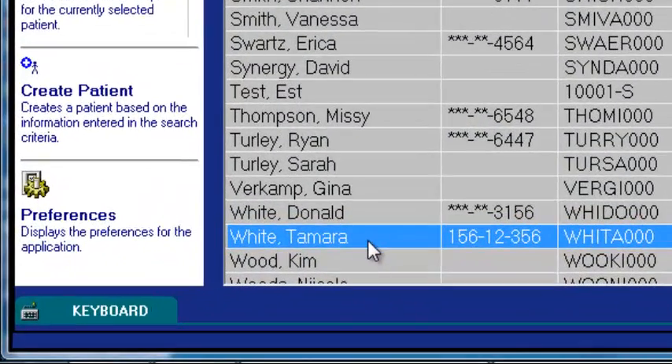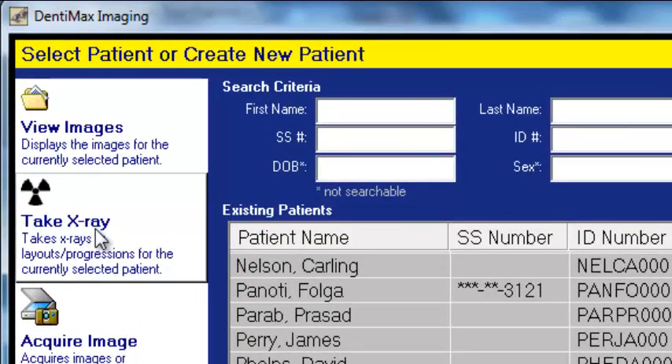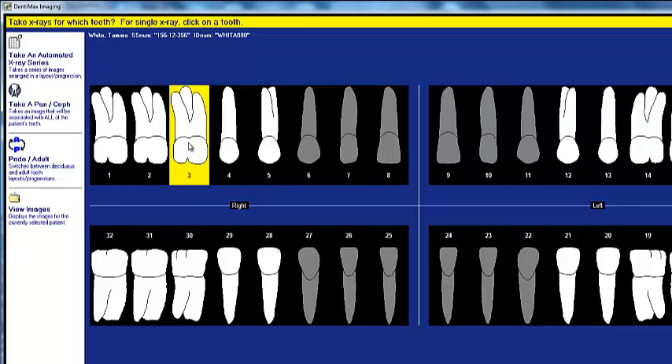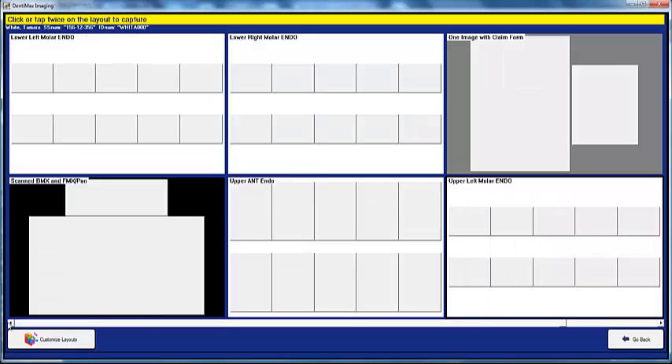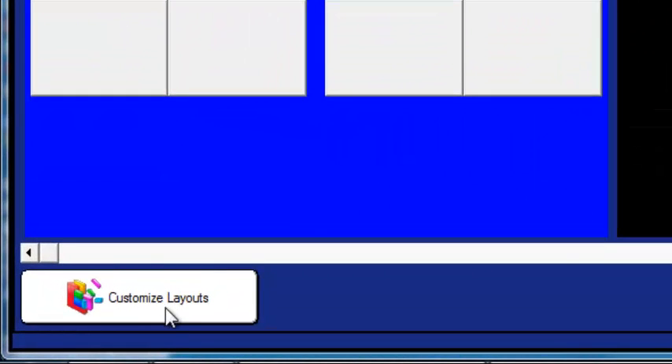Here we are looking at Tamara White. To take an x-ray, all you have to do is tap this oversized Take X-Ray button — it's hard to miss. When we click on that, we can click on a single x-ray to take a PA, or we can click on our automated x-ray series button. You have virtually any mount available for taking x-rays, and if you don't have one, you can create your own customized layout, or we can do it for you.